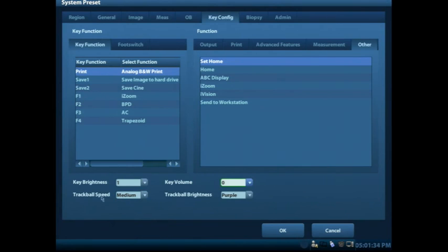As well, you can change the trackball speed and the key brightness. And those are all different settings you can have.